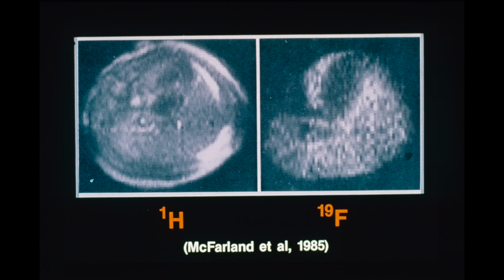This is a rat abdomen proton spectrum, and then after being injected Flosol-DA, a fluorinated blood substitute, we can see that the fluorine has been taken up by the liver. The stomach now comes out as being dark, whereas we see some signal from here. Again, although interesting as an experiment, the acquisition time on this image was 3.5 hours. So in terms of usefulness from an imaging standpoint, it doesn't look very good. On the other hand, doing a localized phosphorus spectrum could take much less time.